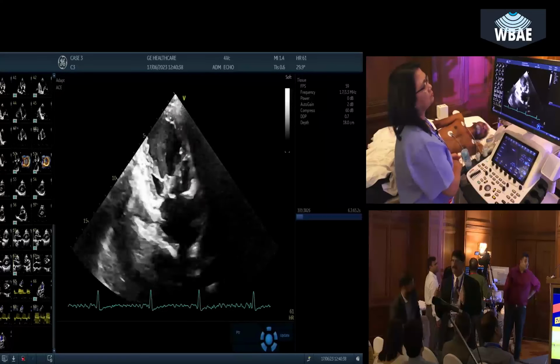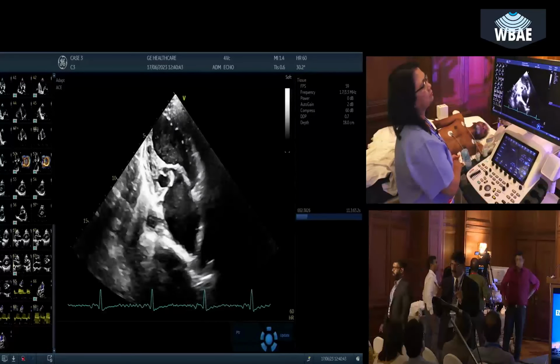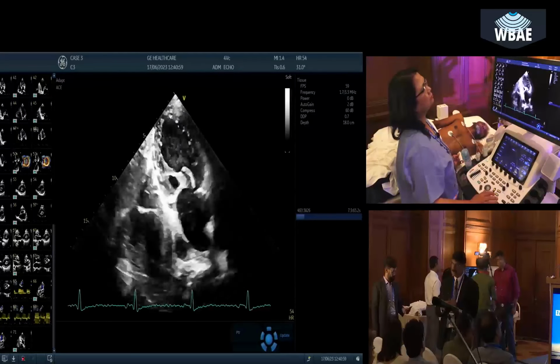First, subvalvular pathology has to be seen only in parasternal long axis because you get the structure exactly perpendicular to your insonifying beam. You do it in 4-chamber or 2-chamber, you will make a mistake. A lot of people do it in 2-chamber where subvalvular pathology looks terrible. That's not the way to look at it. In parasternal long axis view, the chords are directly perpendicular to the insonifying beam. This is the way to do it.